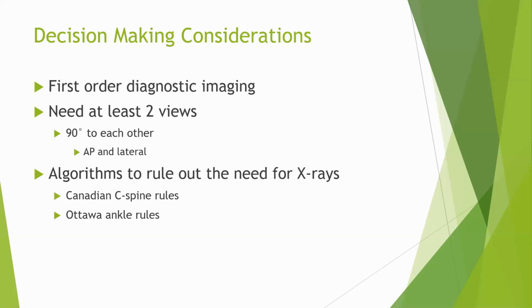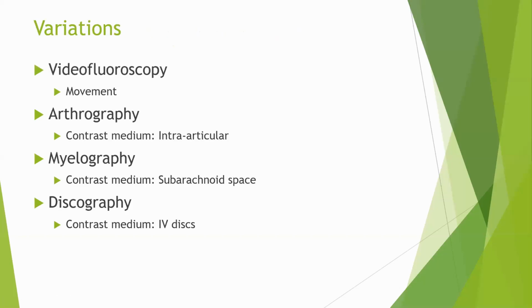Exactly similar to the C-spine is your ankle joint. It is a very straightforward flow chart that you can Google to know if a radiograph is needed. Now you can ask me, okay, you have given C-spine and ankle, what are the rest? Well, unfortunately, there are none till today, or till last night. So till now, we have only two sets of rules: one for the cervical spine or neck, for acute injury or road traffic accident where someone went through a whiplash, and then we have some ankle rules too.